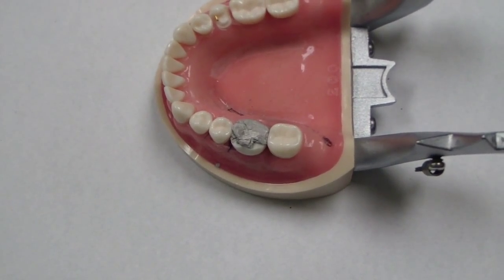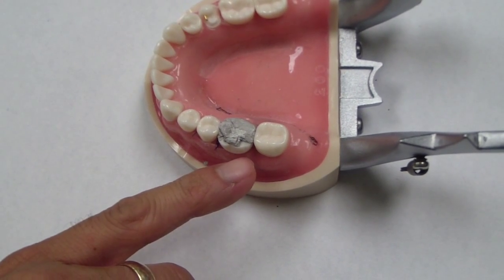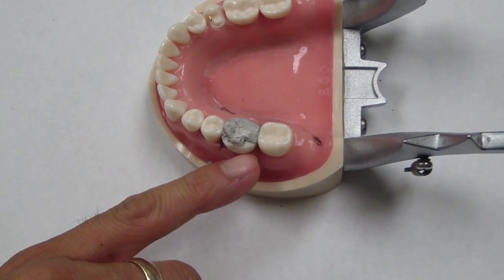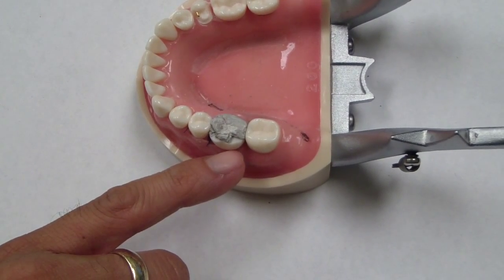Hi folks. Here's a great tip that Dr. Big Daddy passed along to me. It has to do with deeming that a tooth needs an indirect restoration — so you're going to place a crown on this tooth.